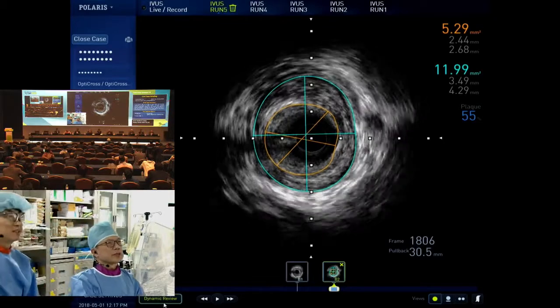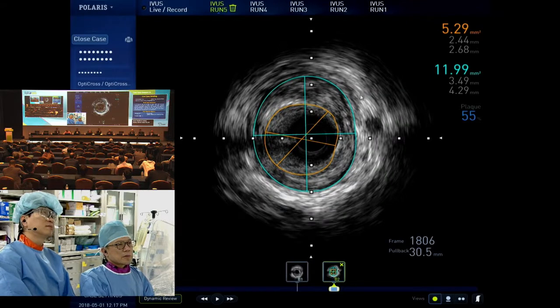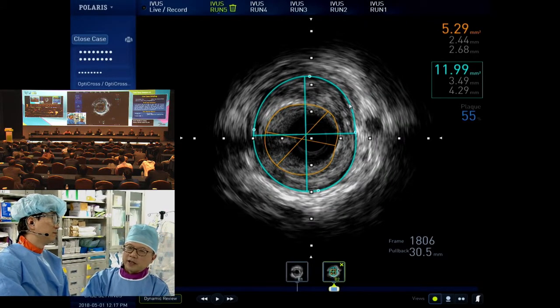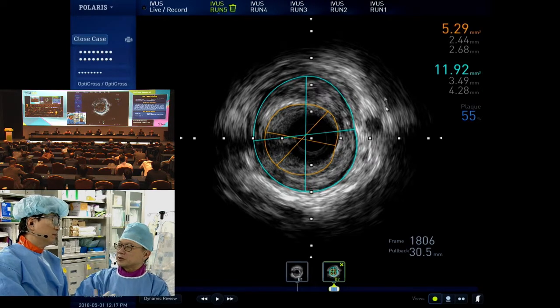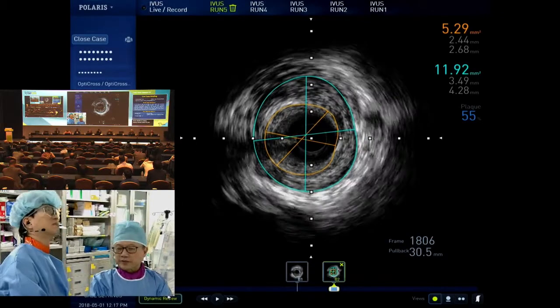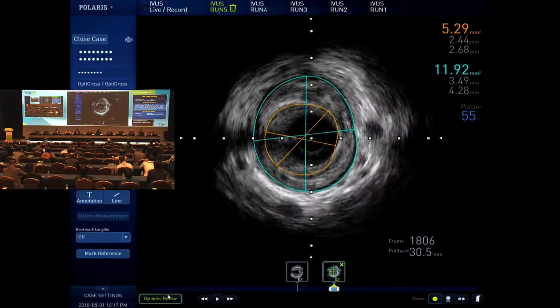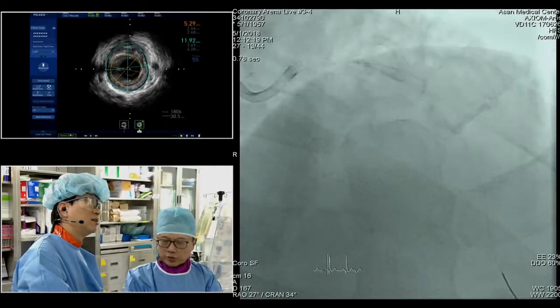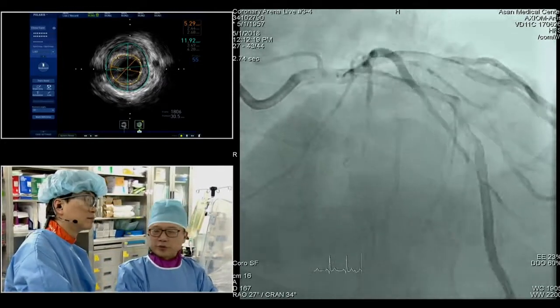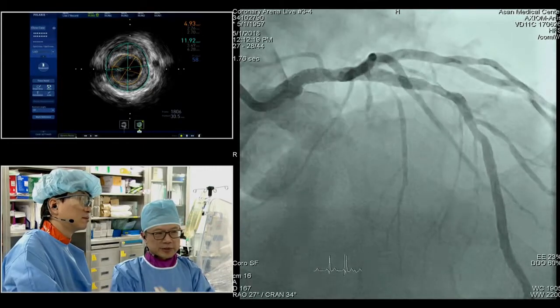I think that's okay because there's a little bit of blood. So I think, obviously, if we do physiology and imaging, we usually leave behind lesions that may not be so pretty. So the question we have is mainly fixing the most important physiological part. If we have time, we can certainly do an FFR, but obviously it's costly. Once I use one imaging modality, I try not to use multiple ones because it is expensive to keep opening up different modalities, especially in the States. Some of it is not reimbursed well.